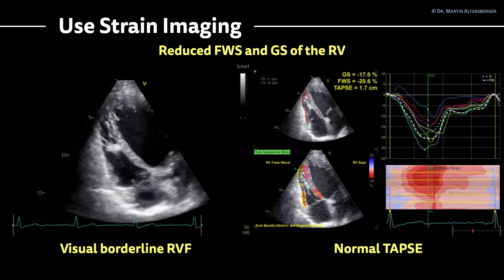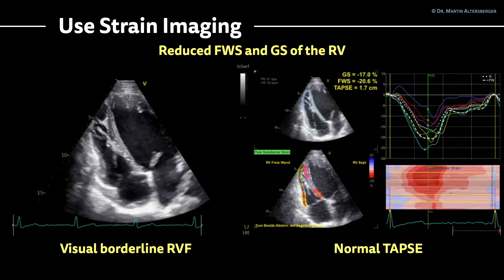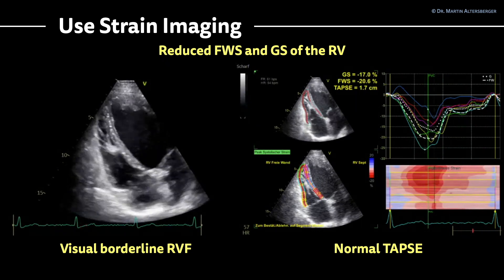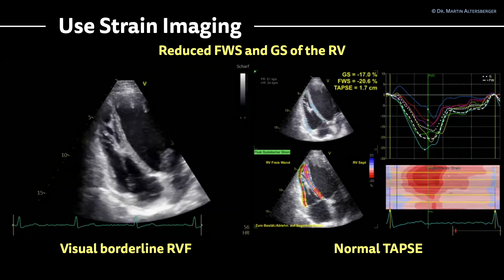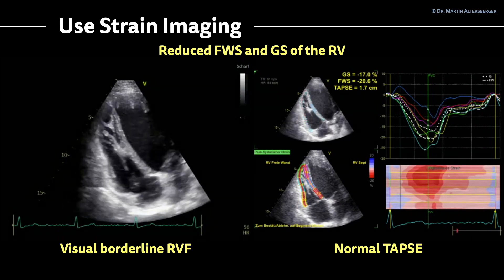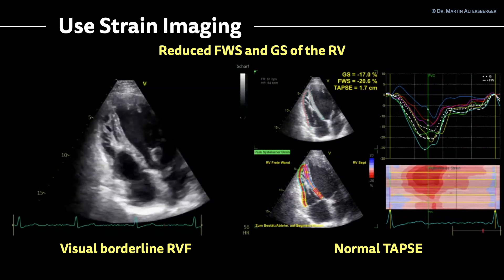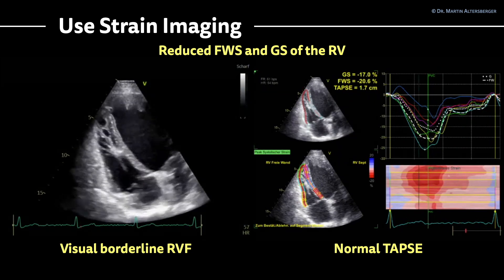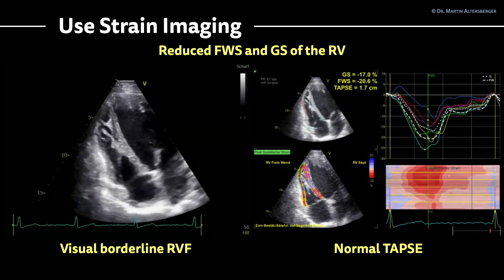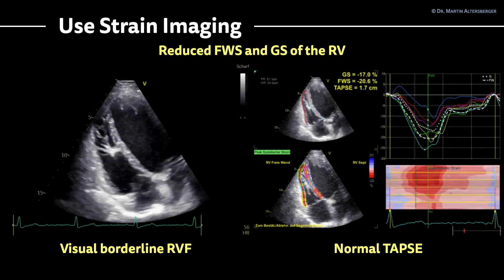TAPSE is, as expected from the visual assessment, normal to borderline normal at 17 millimeters. The global strain is also mildly reduced. So the visual borderline to mildly reduced right ventricular function is confirmed with strain imaging, giving you another follow-up parameter in this patient.